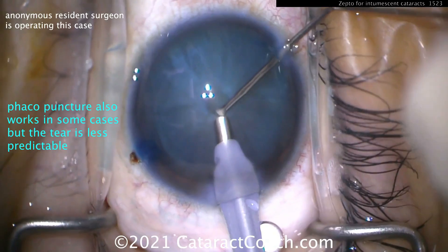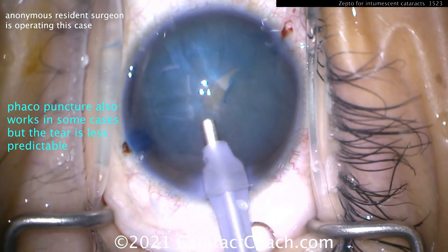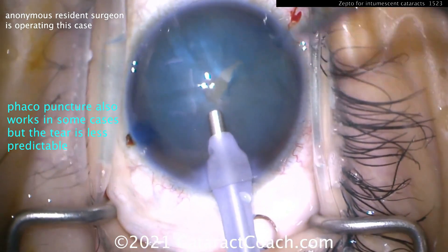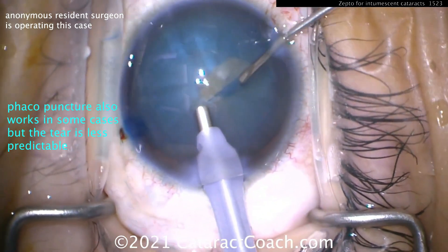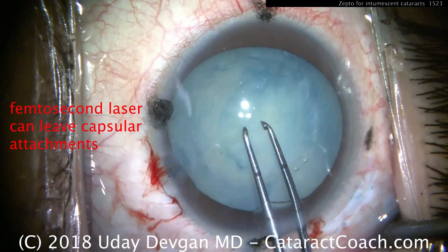We've also talked about the double rhexis technique here. Here's buzzing in with a phaco probe — phacopuncture. That can work as well in some cases, but the tears are a little bit less predictable. So now keeping the probe in the eye with high infusion and trying to finish it.